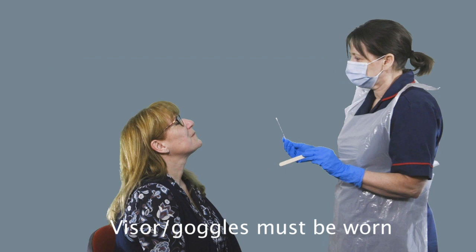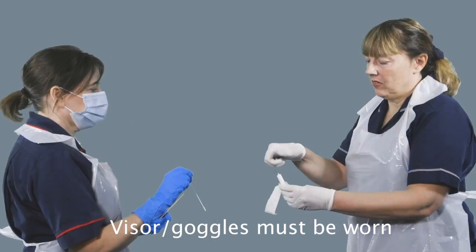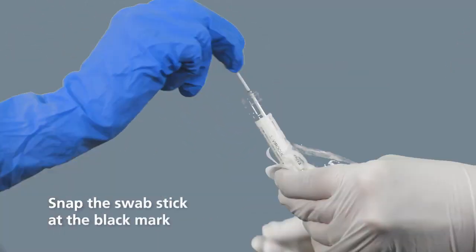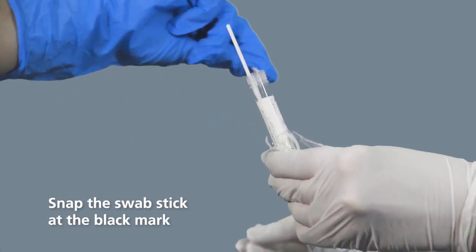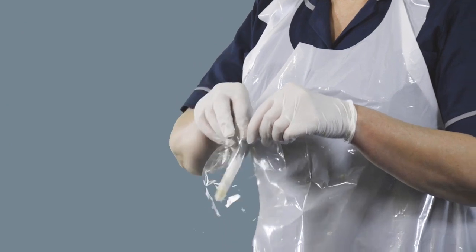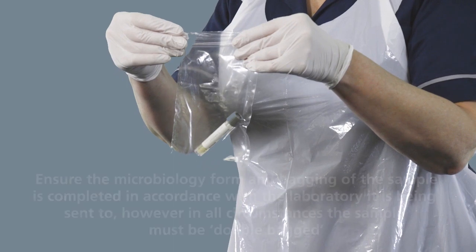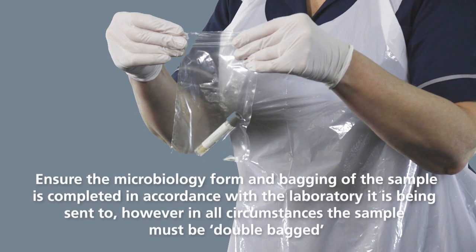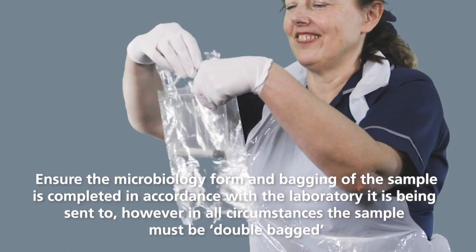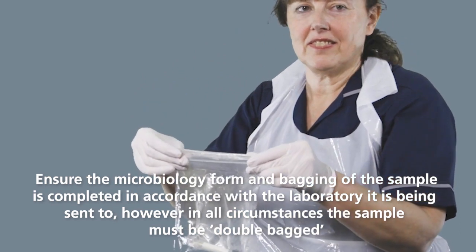Having now taken your swab, you need to return the swab to the clean nurse who will be holding the vial ready. They will have removed the lid of the vial. Place the swab into the vial, snap it at the marker on the swab, and the lid is then closed. The vial is then placed into a plastic bag as provided by the laboratories. This needs to then be double bagged — place it into the second microbiology bag and attach the appropriate documentation.